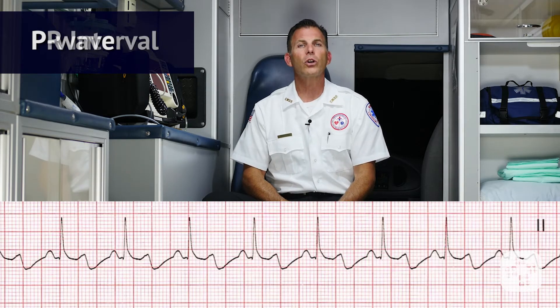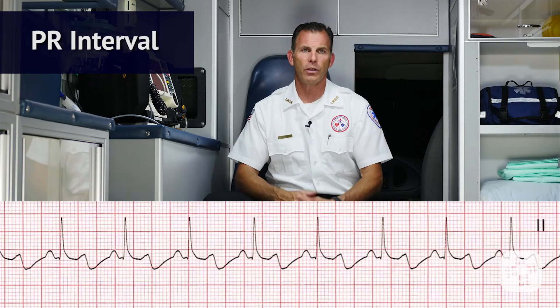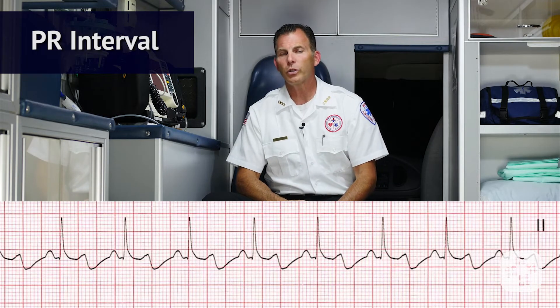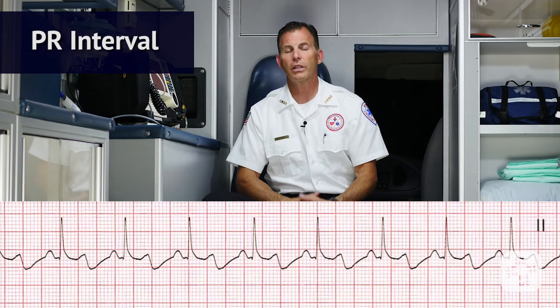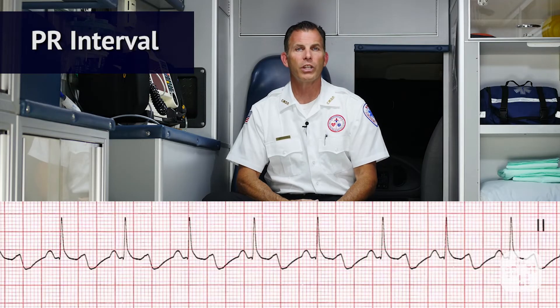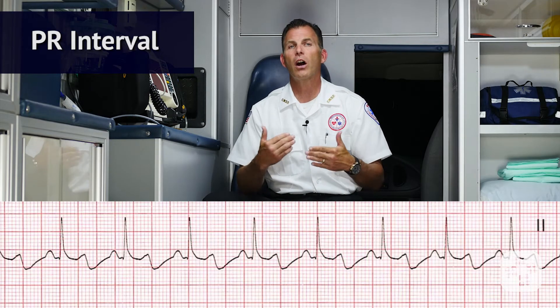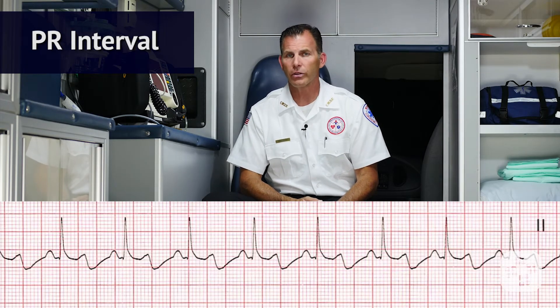Now we want to look at the PR interval for this ECG. Is the PR interval normal, meaning less than 0.20 seconds? The answer is yes, because the PR interval is contained within one large box, which equals 0.20 seconds, so the PR interval is normal. Is the PR interval constant? And the answer is yes.